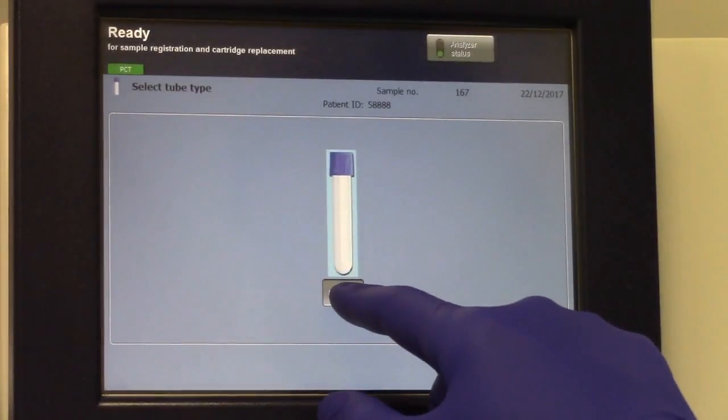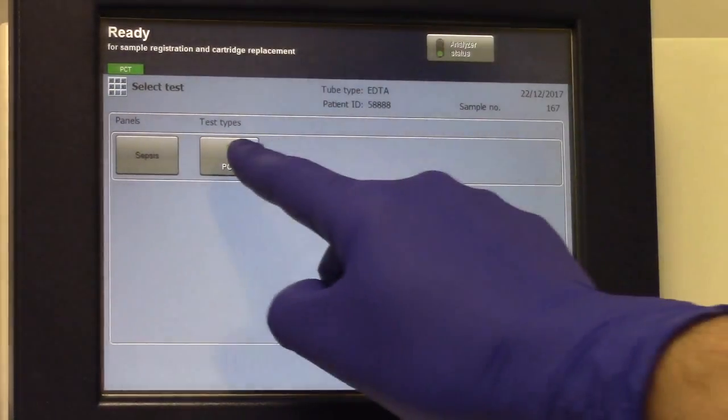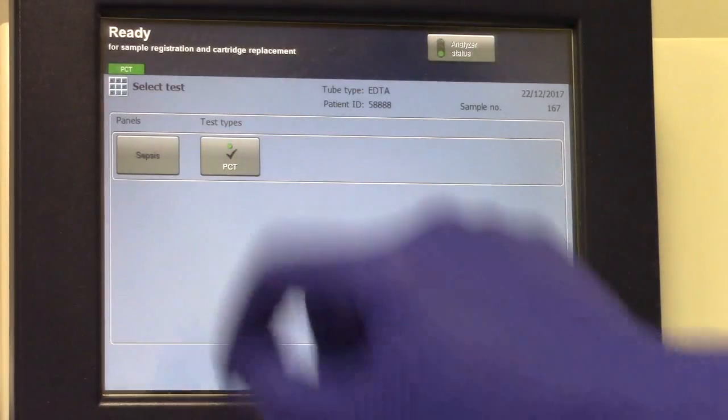Press EDTA on the screen, then select the PCT test and press Start.